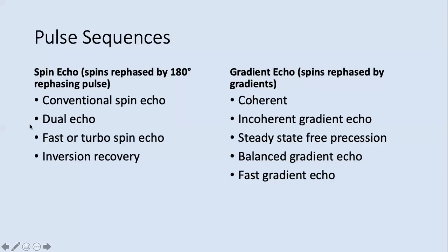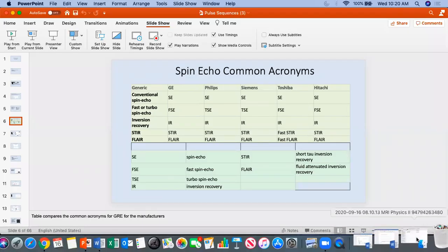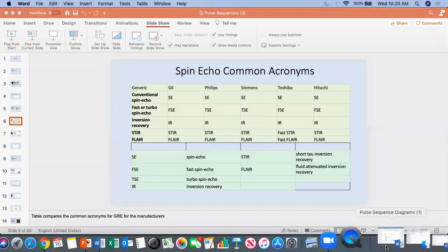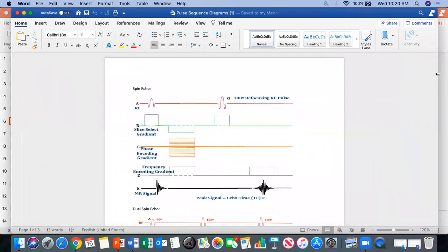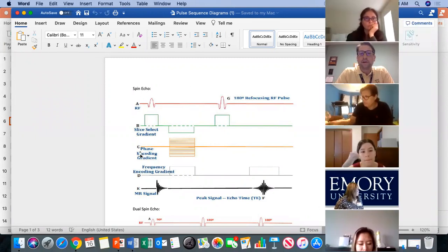So before we get into that, I want to go over this diagram, these pulse sequence diagrams. All right, so if you have this, it's under modules. And quickly just go through each of the diagrams of the ones we've already covered. Okay. So we've seen this one.